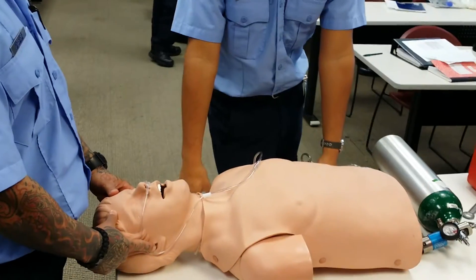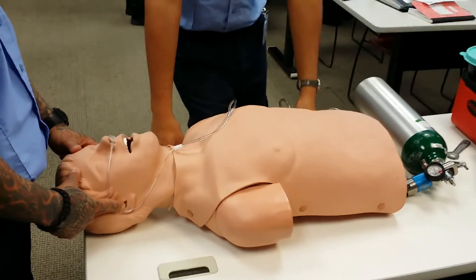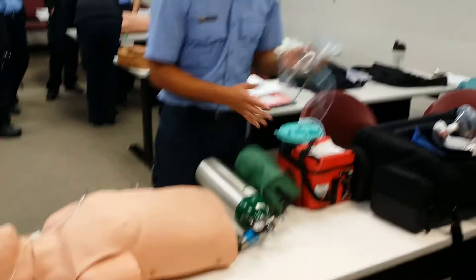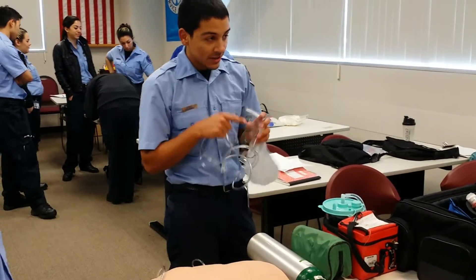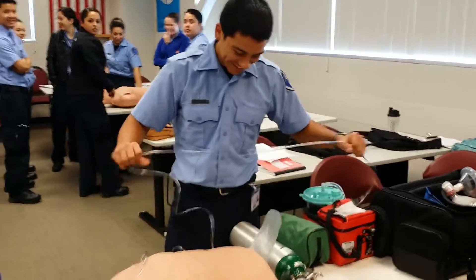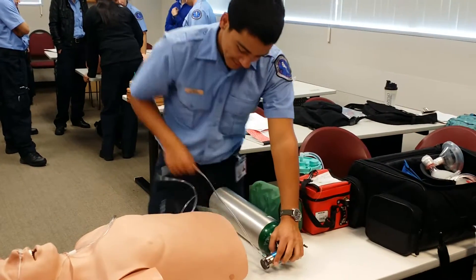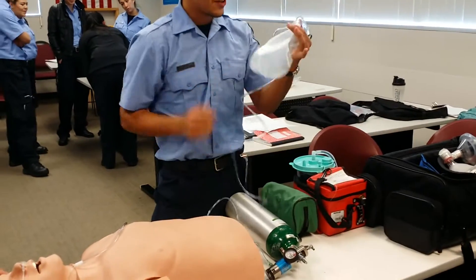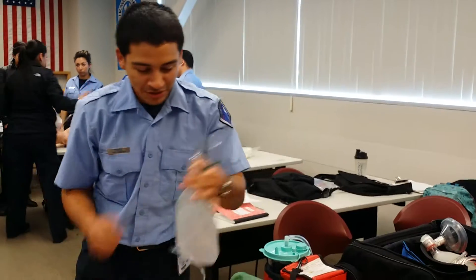How's the oxygen doing for you? It's not doing good at all — I'm actually having chest pain. I'm going to bump up this patient to a non-rebreather mask now. This is my non-rebreather mask — this is for big, sick patients. The flow rate on this is going to be 10 to 15 liters per minute. I'm going to fill this reservoir bag — just place my thumb over it, fill it about halfway full. It doesn't have to be completely full, about to explode.